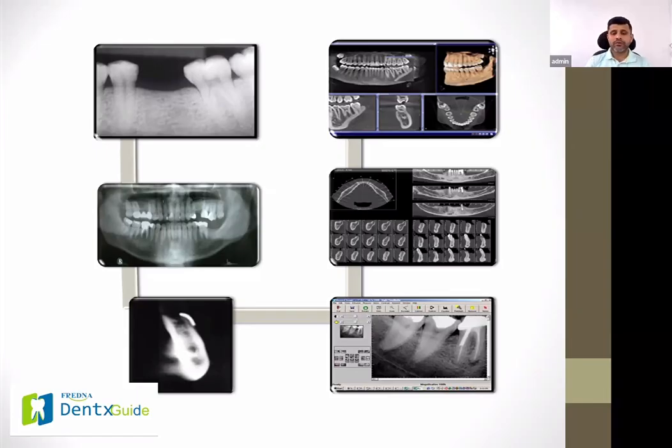What we needed for implant planning, or to see an object in all the planes, was a third dimension, the mesio-buccolingual view, which you see here. That we first got in the CT scan. So CT scans were the first modality which gave us the three-dimensional view. But the disadvantages of the CT scan were that the dose was too high, secondly, it was too expensive, and third, the image resolution was not that great. All these three problems were solved by CBCT.